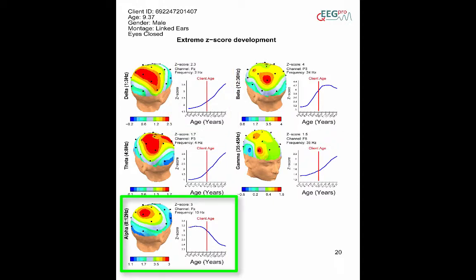On the other hand, this client also has an excess in parietal alpha power, which is depicted at the bottom left corner. The age progression at this z-score shows the opposite pattern.